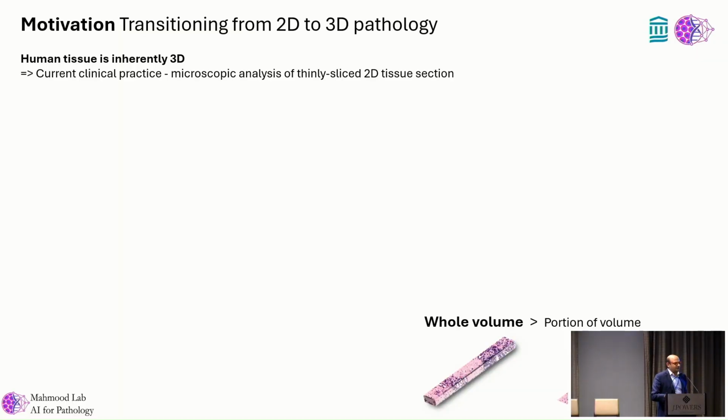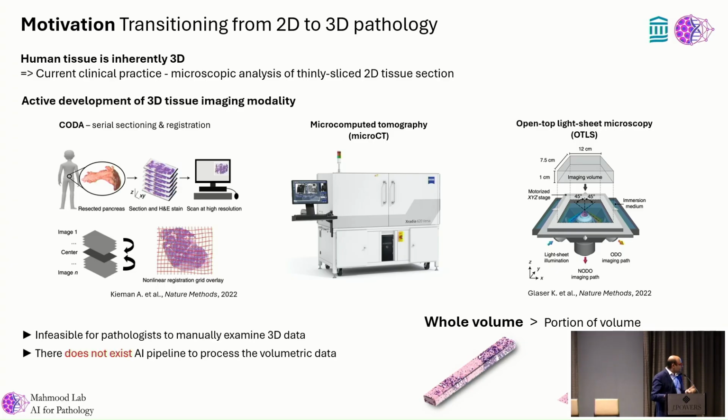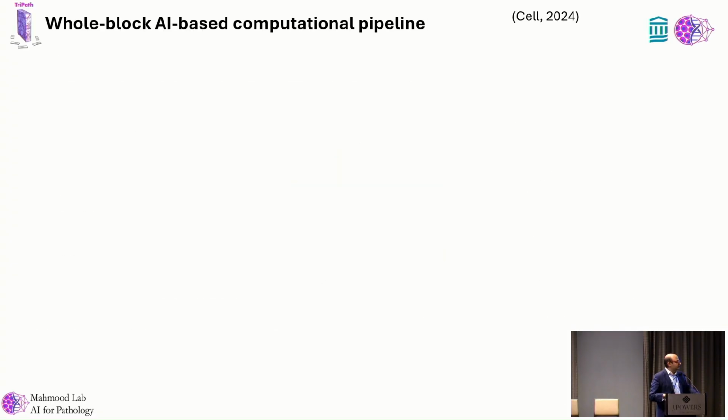We've also been very interested in 3D pathology. So human pathology today is two-dimensional, but tissue is three-dimensional. So we often miss a lot of stuff. There's been over a dozen studies showing that if you cut additional sections from blocks, the diagnosis changes. And there's all this work in trying to image tissue in 3D. There are limited computational frameworks. 3D volumes of tissue can be difficult to analyze. It's also more difficult to discover from these very massive pathology images that are large to begin with. If you add another dimension, they become very, very large.